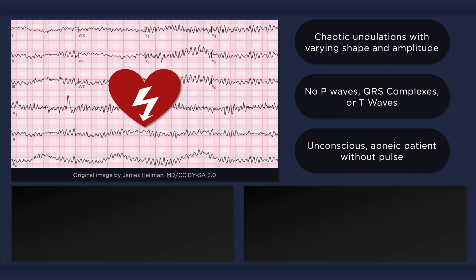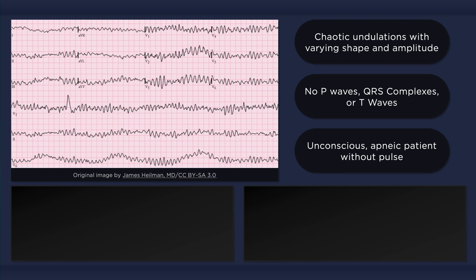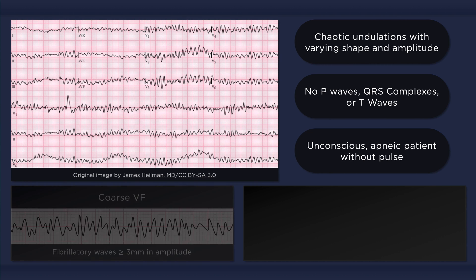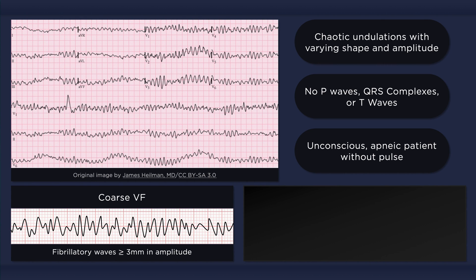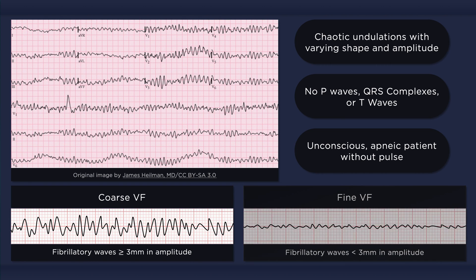For more information on management, please check out the latest ACLS algorithms. Ventricular fibrillation can be classified as coarse or fine. In coarse VF, fibrillatory waves are 3 mm or more in amplitude. In fine VF, the fibrillatory waves are less than 3 mm in amplitude. When the amplitude of the waves is low, the ECG reading may be confused with asystole — a distinction that is important because asystole is not a shockable rhythm.